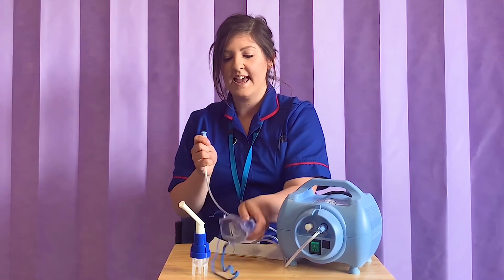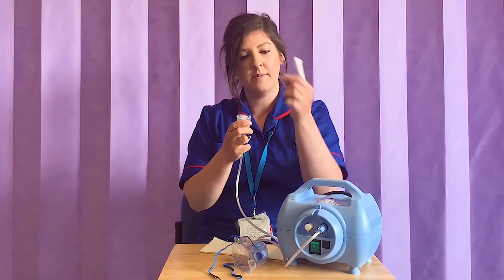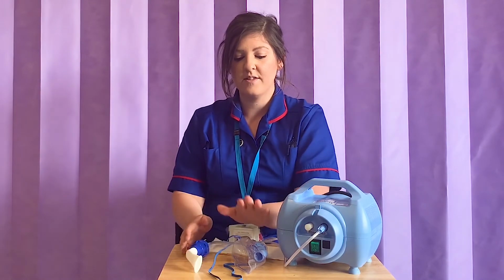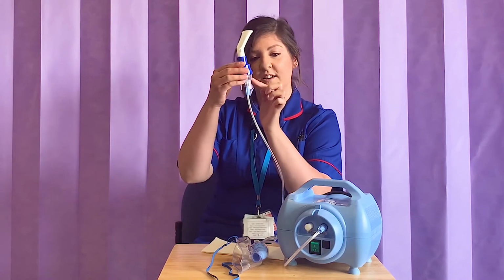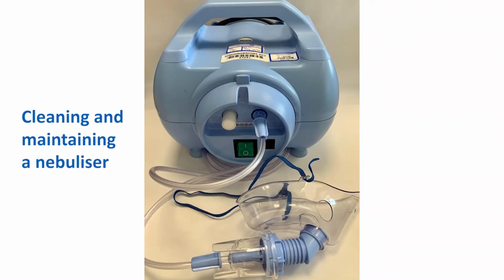With a mouthpiece, again, there is a medication chamber attached at the bottom that you can unscrew, pop your medication in, attach the mouthpiece, and then you can inhale the medication through your mouth. With both of them, you need to make sure that you're sat in a nice, comfortable, relaxed position, and that you just breathe in and out normally whilst you wait for your medication to fully compress through the nebuliser. You'll know that that's finished when the steam stops appearing, and you should see that your medication has completely run out of the chamber.